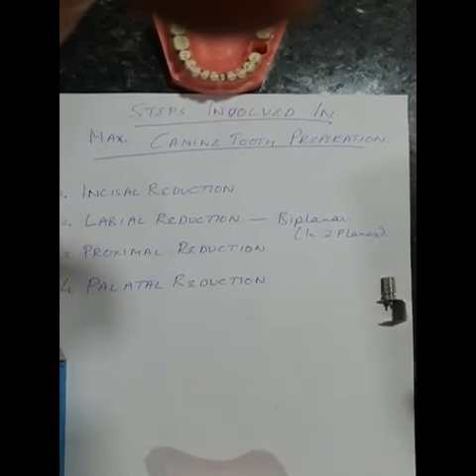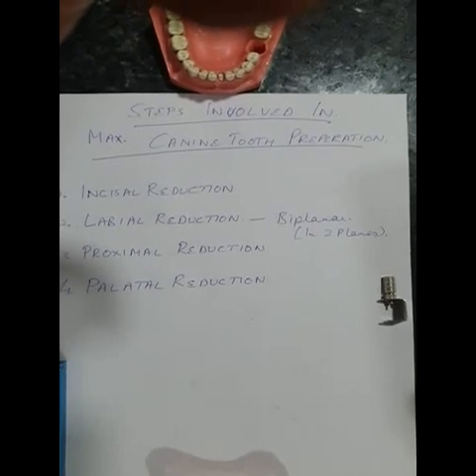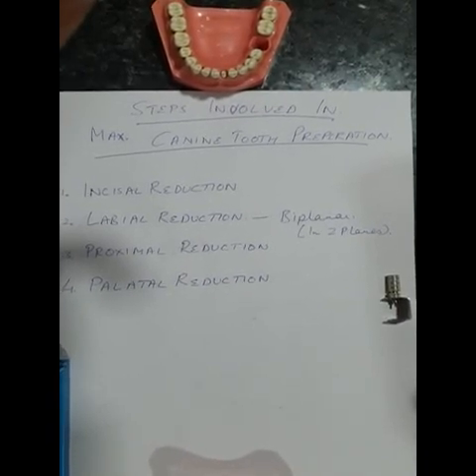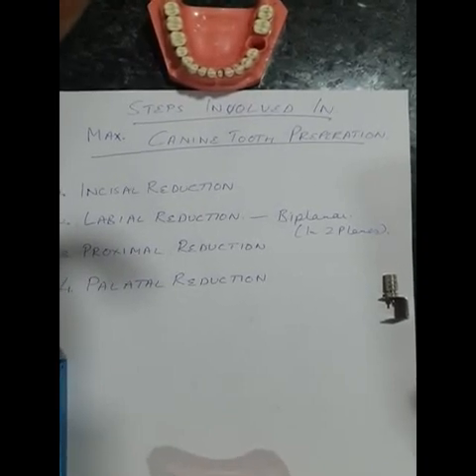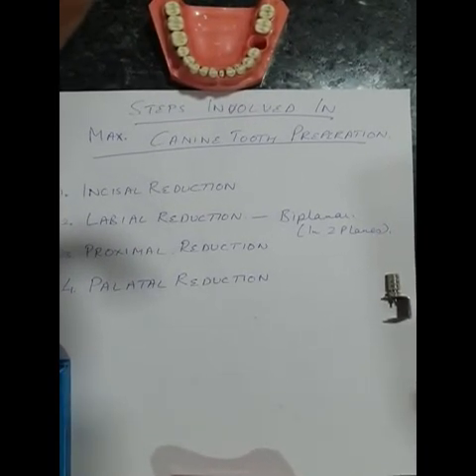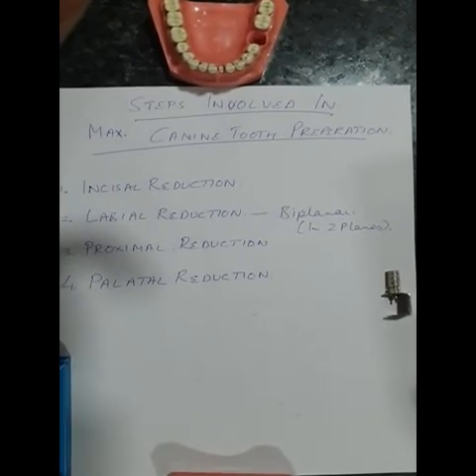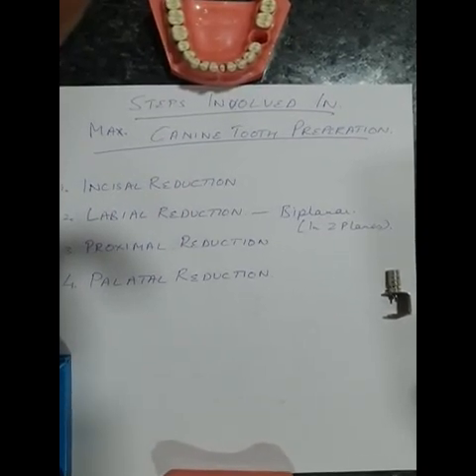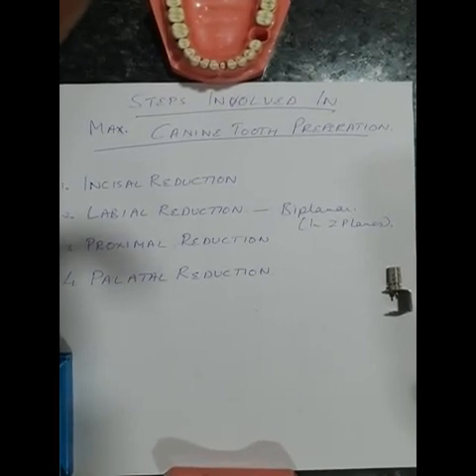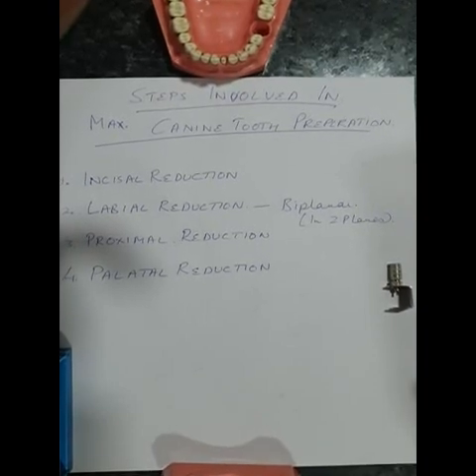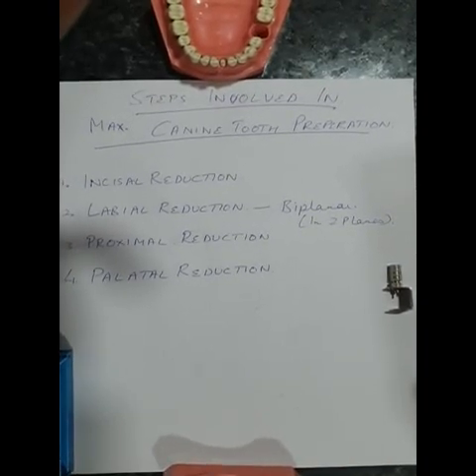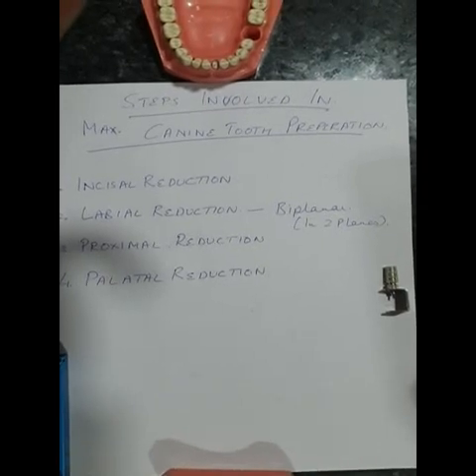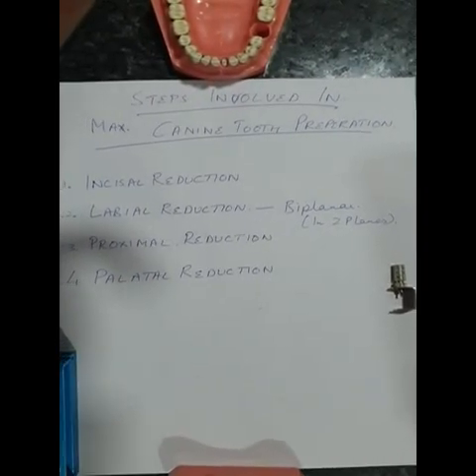Once you have given the depth orientation grooves in the incisal two-third region, then focus on the cervical one-third. While giving depth orientation grooves on the cervical one-third, the bur should be positioned along the long axis of the root, so that the grooves in the incisal two-third and the cervical one-third are at different angles. Once these grooves are given properly, we reduce the labial surface, taking care not to reduce more tooth structure than indicated by the depth orientation grooves.